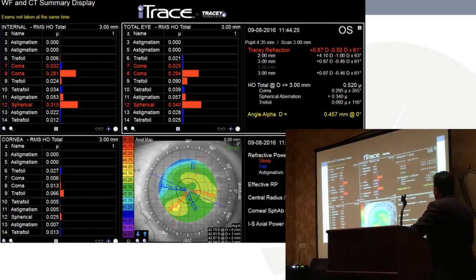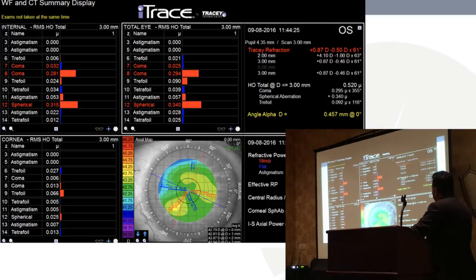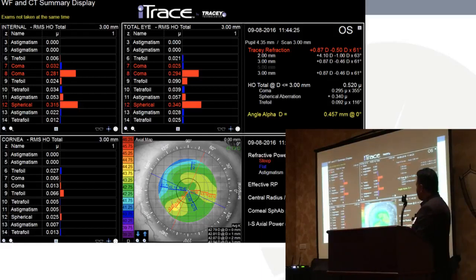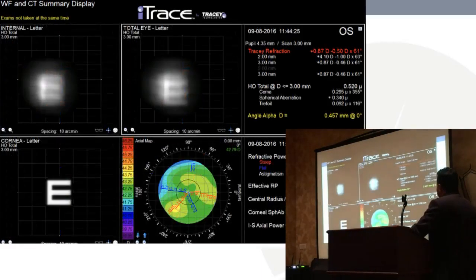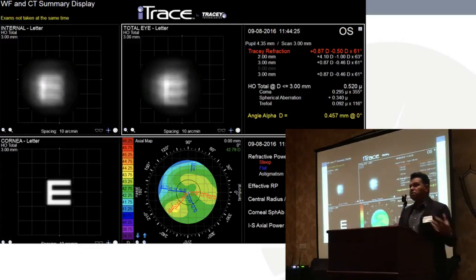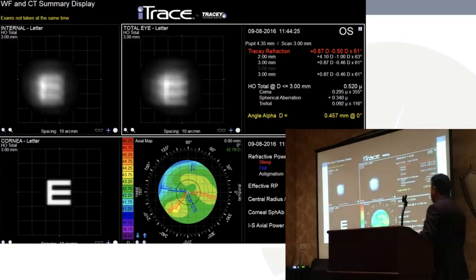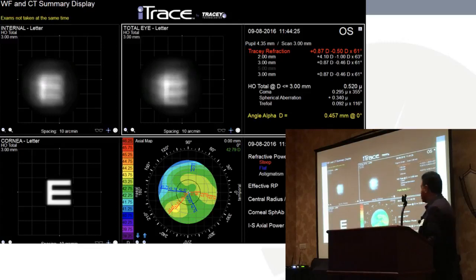We put her on the iTrace — this is the Chang display of the left eye. The corneal irregularities are very minimal, a fairly normal-looking cornea with low anterior astigmatism and all indices looking great. But when you look at the total, you see so much more — a lot of coma, a lot of spherical aberration — and it's really not coming from the cornea; it's all coming from the internal numbers. This is a great tool not only to understand what's going on, but to show patients what's happening.